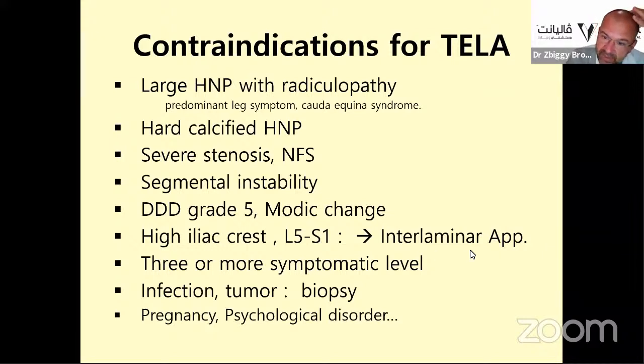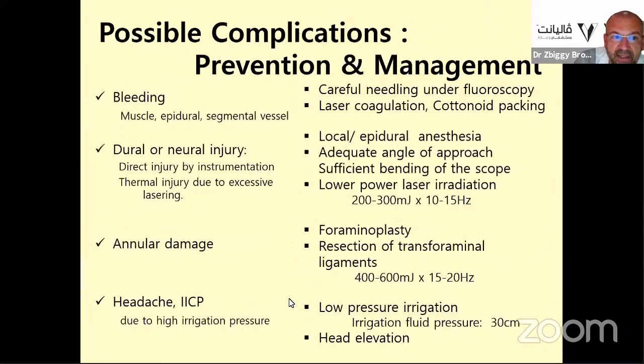At the level L5-S1, rather the interlaminar approach is recommended. Infection, tumor, biopsy is contraindicated. Complications like for the conventional endoscopy: bleeding, dural or neural injury, annular damage, headache, unfortunately can happen.